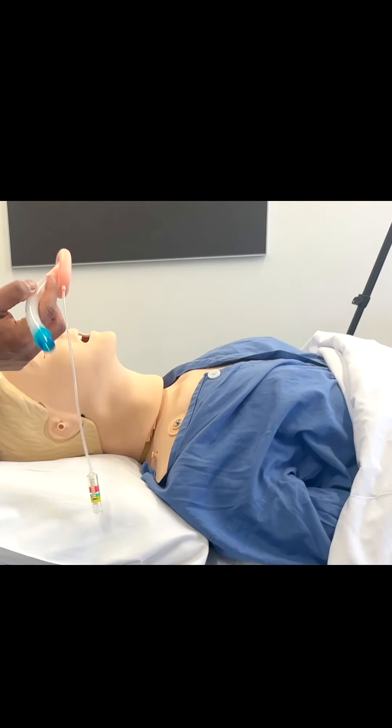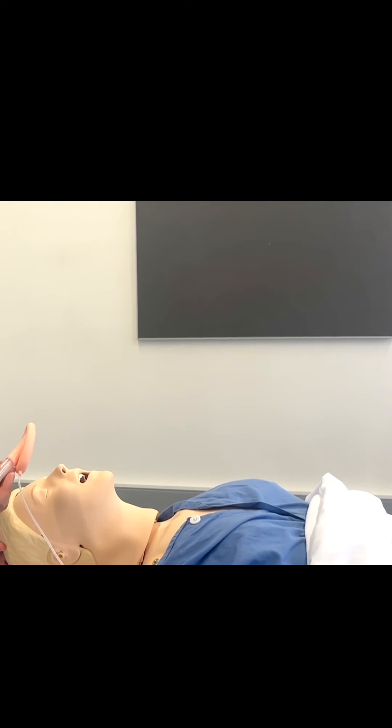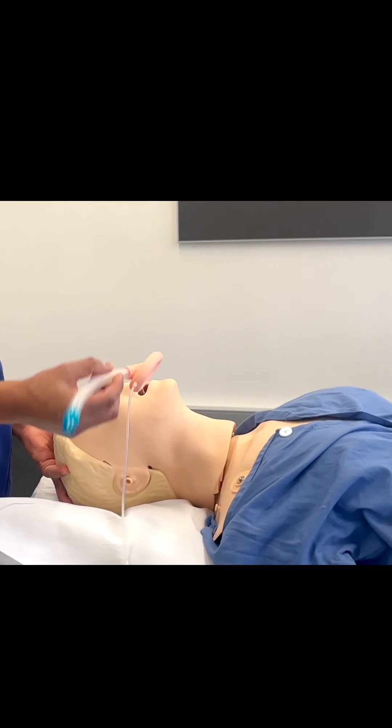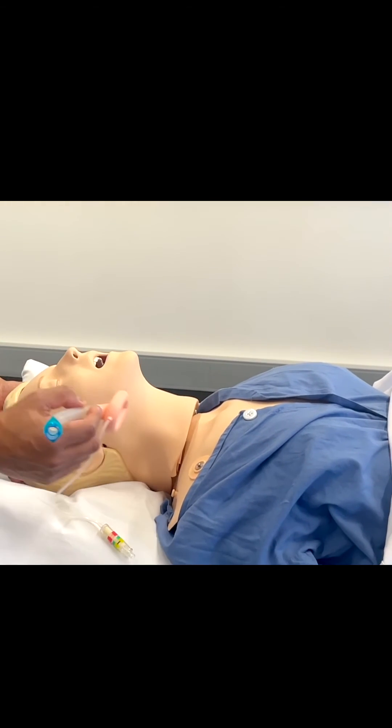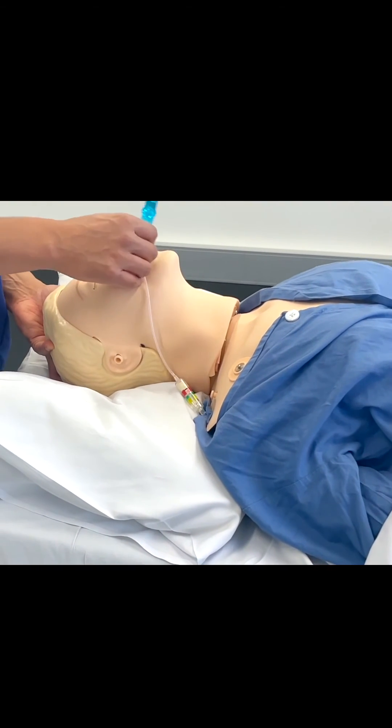You can use your left hand to do a head tilt because you're going to use a right-handed technique to put in the LMA, which will be shown in another video. Often the head tilt creates less of a sharp angle, and you're able to put the LMA in so that it falls in easier.